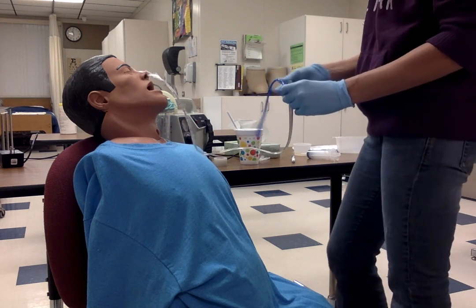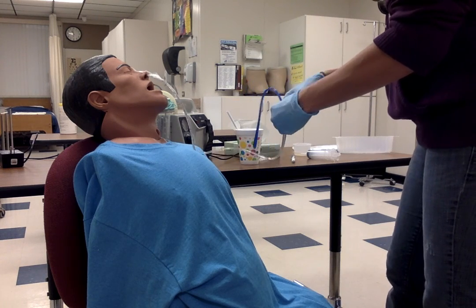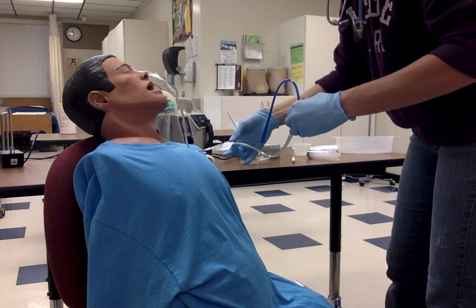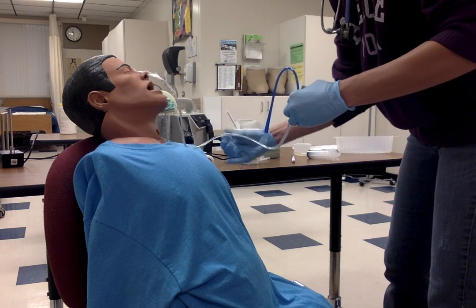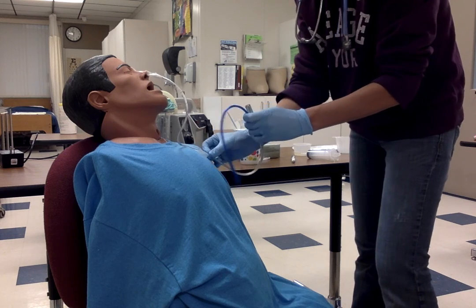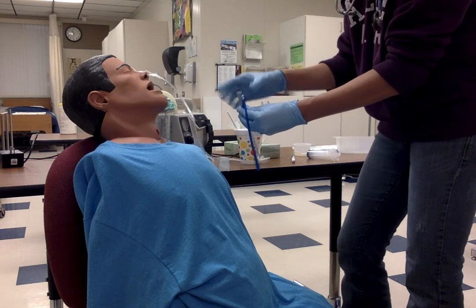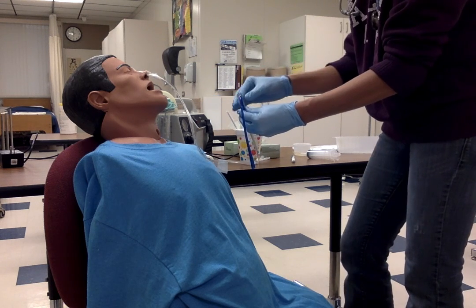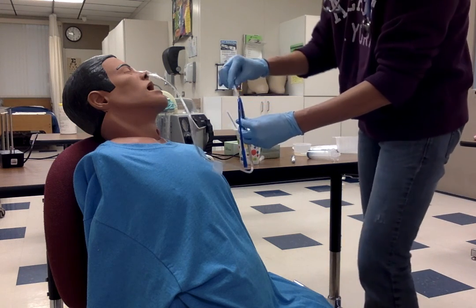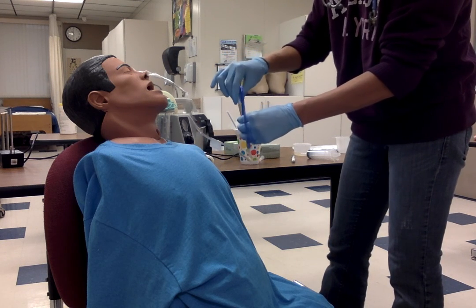So what I'm going to do is get some tape here, and you want to secure this. So first of all, you go around the tube. And even before I would do this, they could still have secretions coming out here at this point. Sometimes they have a lot if they have a full stomach or something like that. So what you can do at this point is use this piece that we wanted to keep, and you can put this back in here.